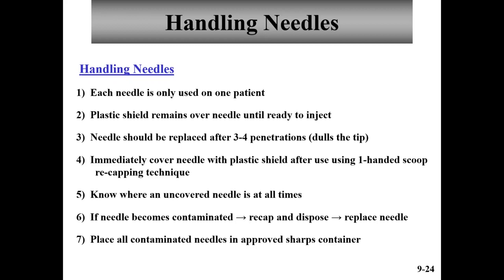But she should have come out, washed her hands, put a new glove on, and replaced the needle. Instead, after sticking herself, she then injected the patient, the student partner. So the student partner then had an exposure, because the student that was the patient was injected with a contaminated needle. So if a needle becomes contaminated, you stop, recap it, dispose of it, and get a clean needle.